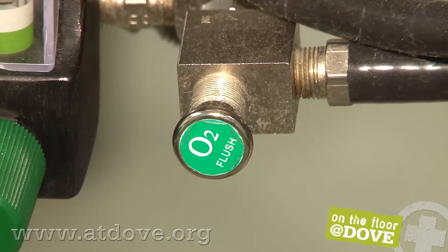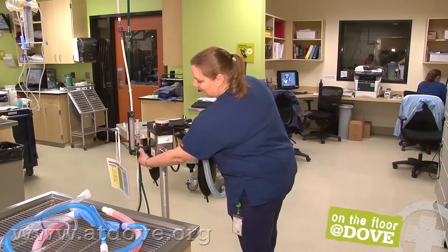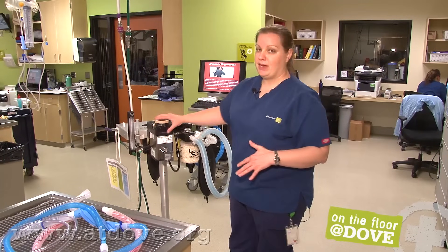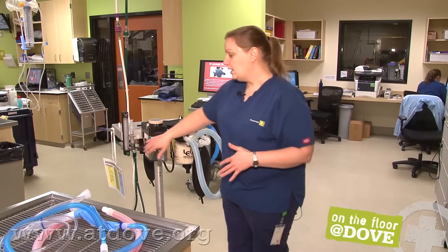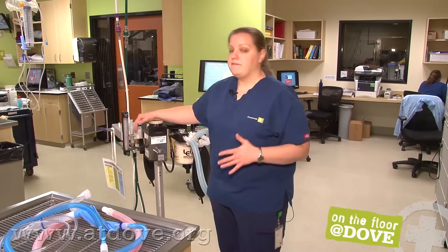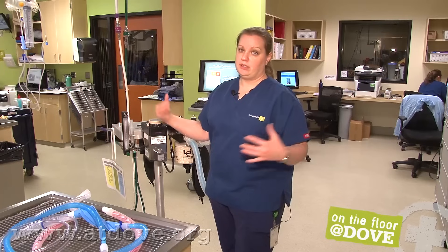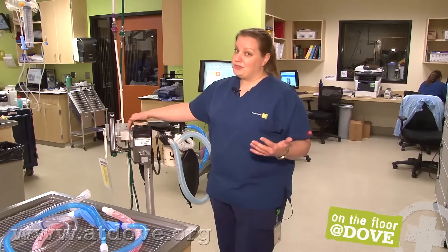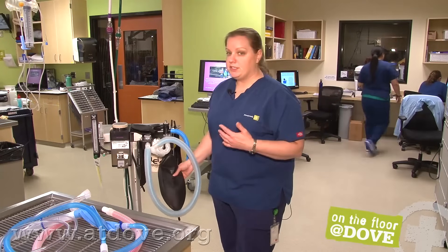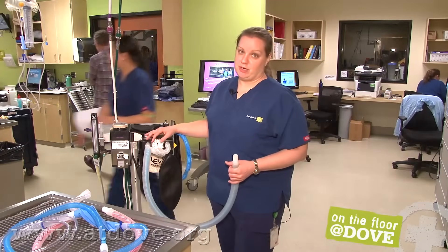I want to mention the oxygen flush valve. There's a little controversy about whether you should use this when it's hooked up to a patient. Basically, when you push the flush valve, you are flooding the system with pure oxygen. It bypasses your vaporizer, so you're not getting any gas into that patient — you'd only use that if the animal needs straight oxygen without any gas. You should never use the oxygen flush valve if your patient is on a non-rebreathing system, as you can increase pressure way too quickly and cause significant trauma. On a larger patient with a standard circuit, you want to watch your pressure manometer and make sure you're not putting too much pressure into the animal's lungs.